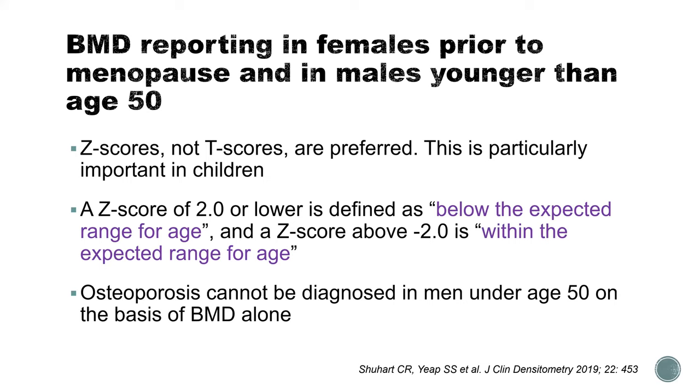There are other causes for low bone density, especially in a younger individual. And again, this just emphasizes that based on bone density, you cannot make a diagnosis of osteoporosis just based on the Z-score.